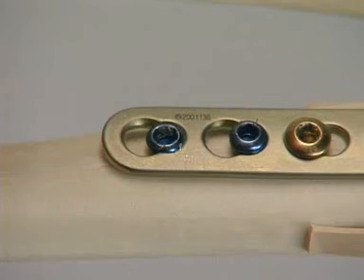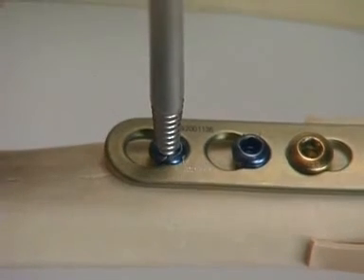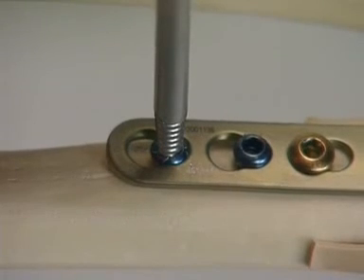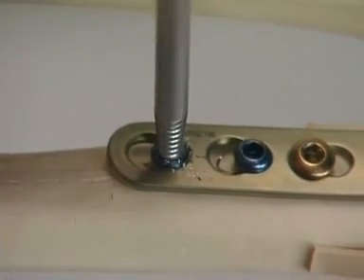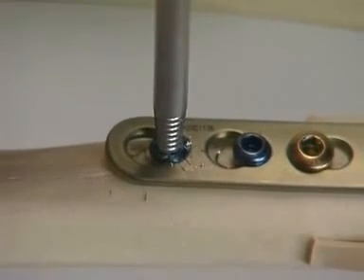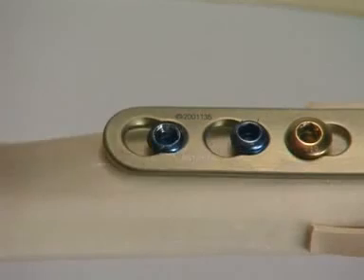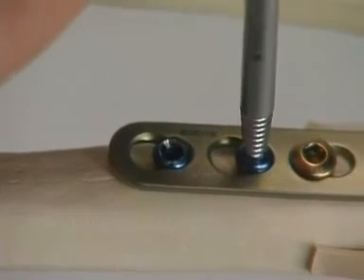The conical extraction screw must be screwed into the damaged hexagonal head of the screw anti-clockwise. This can be done with the air drive at slow speed, or by hand, using an attached T-handle. In rare cases, this procedure is not sufficient. The screw on the right of the picture is removed by this method.